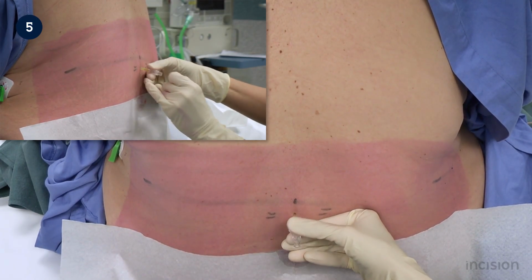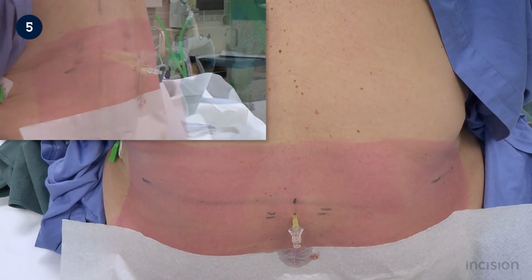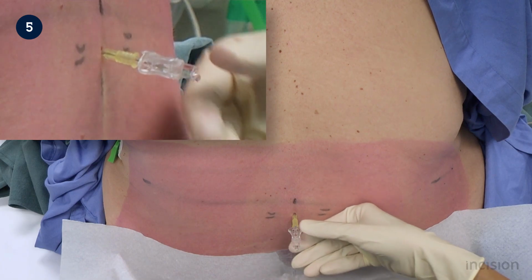To confirm this, the needle stylet is removed and the flow of CSF is watched for. As the CSF drains, take note of its clear quality. If there is blood staining, CSF should be allowed to drain until the blood clears. If the blood fails to clear, it's likely the needle is positioned within a blood vessel. Intravascular injection of local anesthetic carries a risk of systemic toxicity. The needle and introducer should be removed and the procedure re-attempted at a different level.